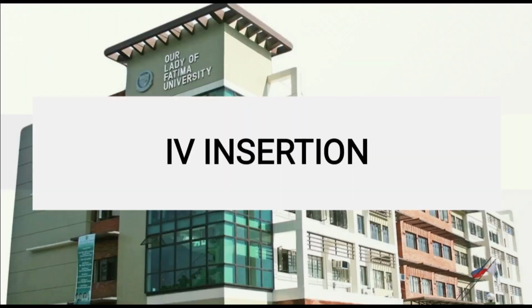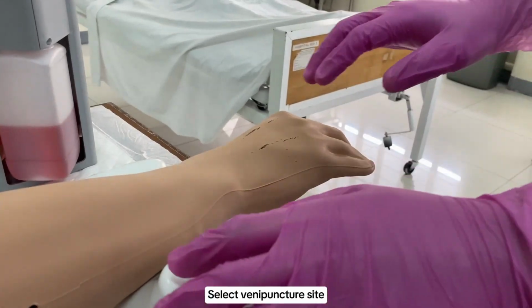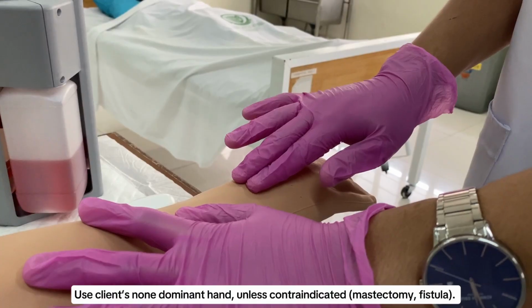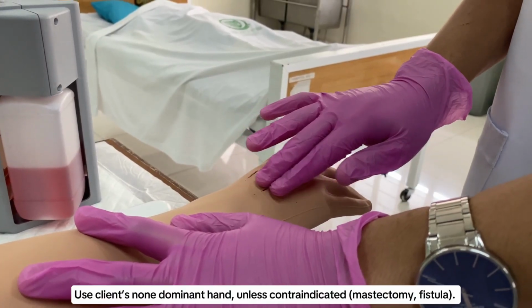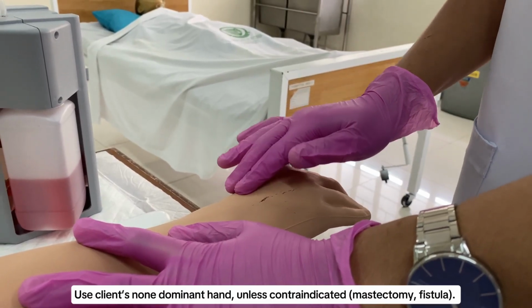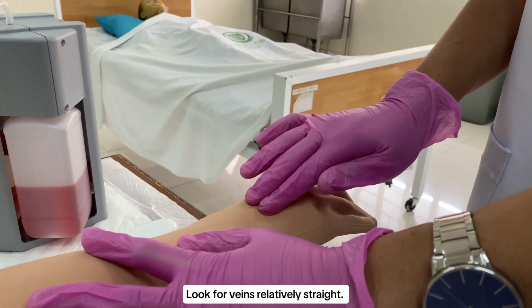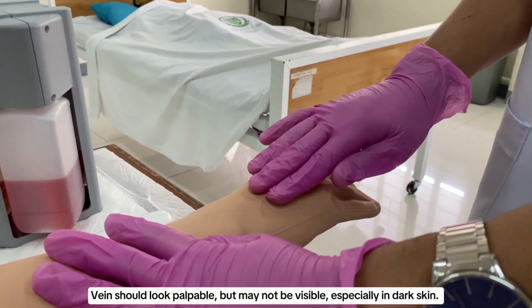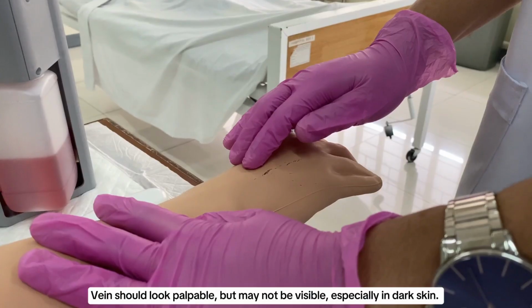Next is the IV insertion. Select venipuncture site. Use the client's non-dominant hand, unless contraindicated, like in clients with mastectomy and fistula. Look for veins relatively straight. The vein should look palpable, but may not be visible, especially in dark skin.